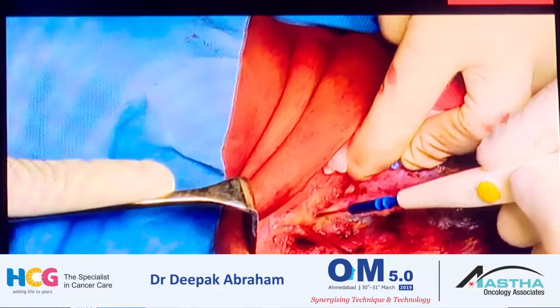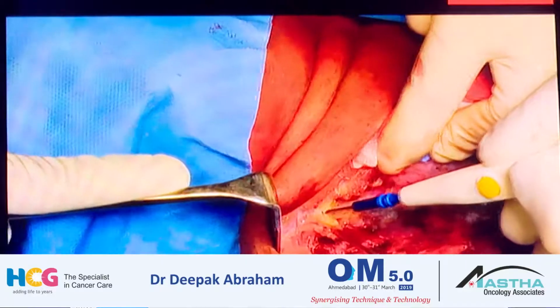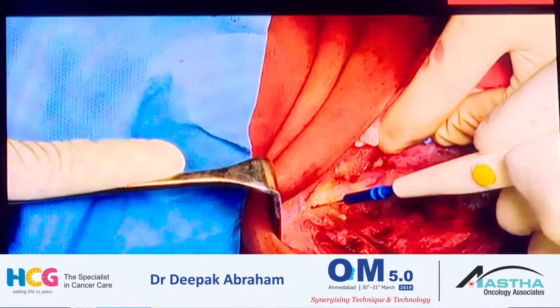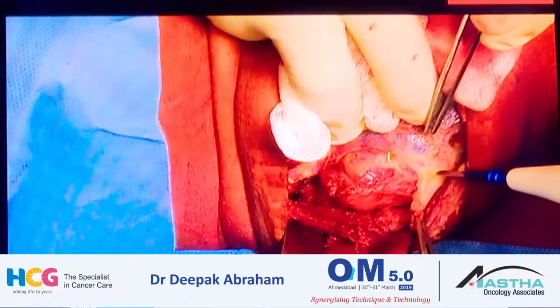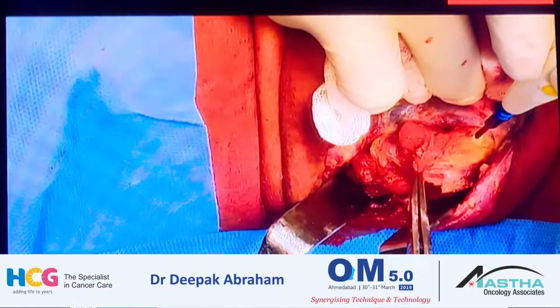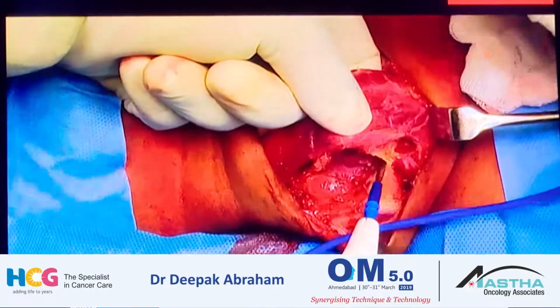I heard in the morning that the en bloc 3, 4, 5 is sent all lateral to the IJV, but what is medial to the IJV would possibly be sent as separate. But I don't think it's really a matter. So that's the bulk of nodal disease, that's lower down, level 4, and a lot of discussion was there about the chyle leak. This is a right side MRND or a functional neck dissection.